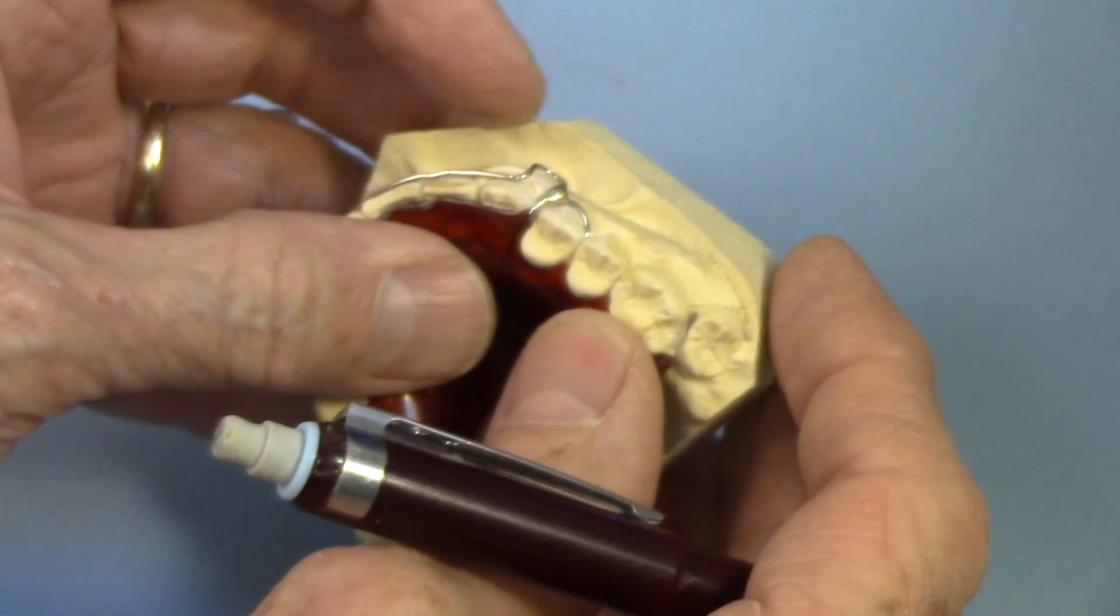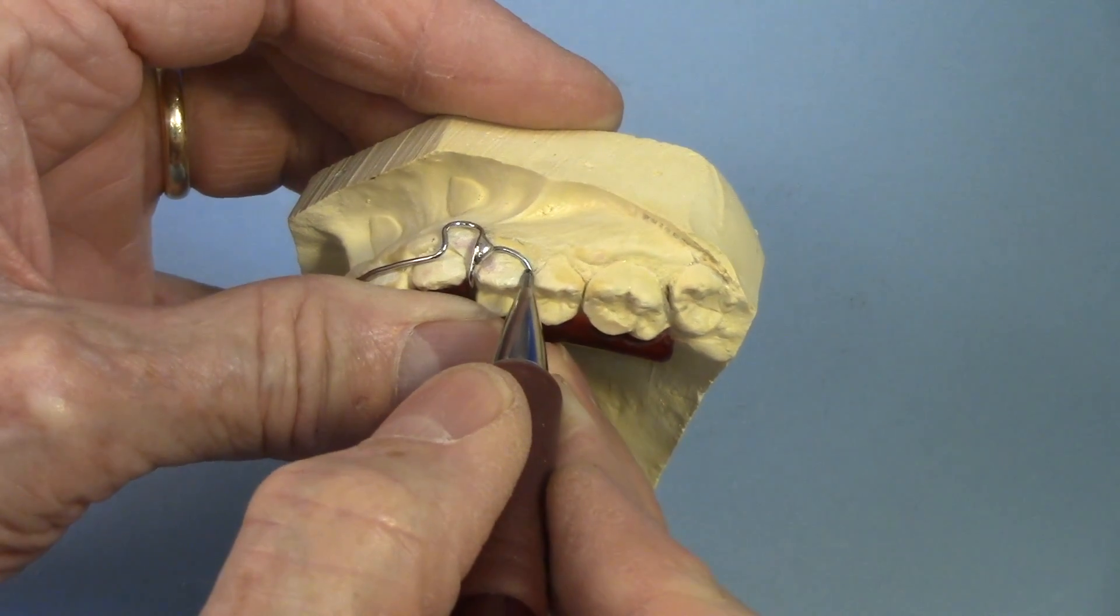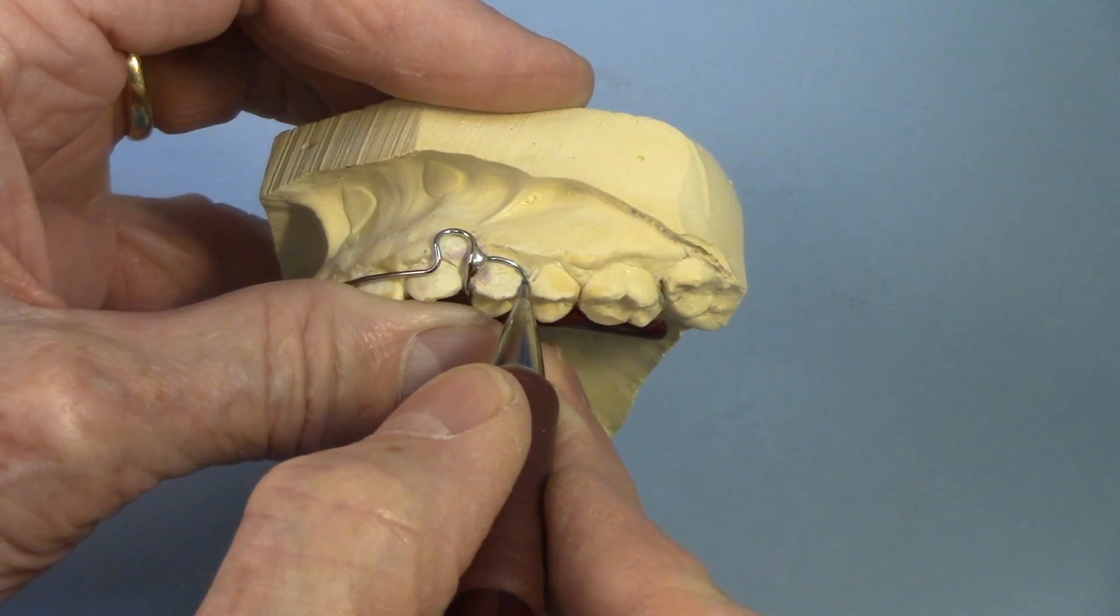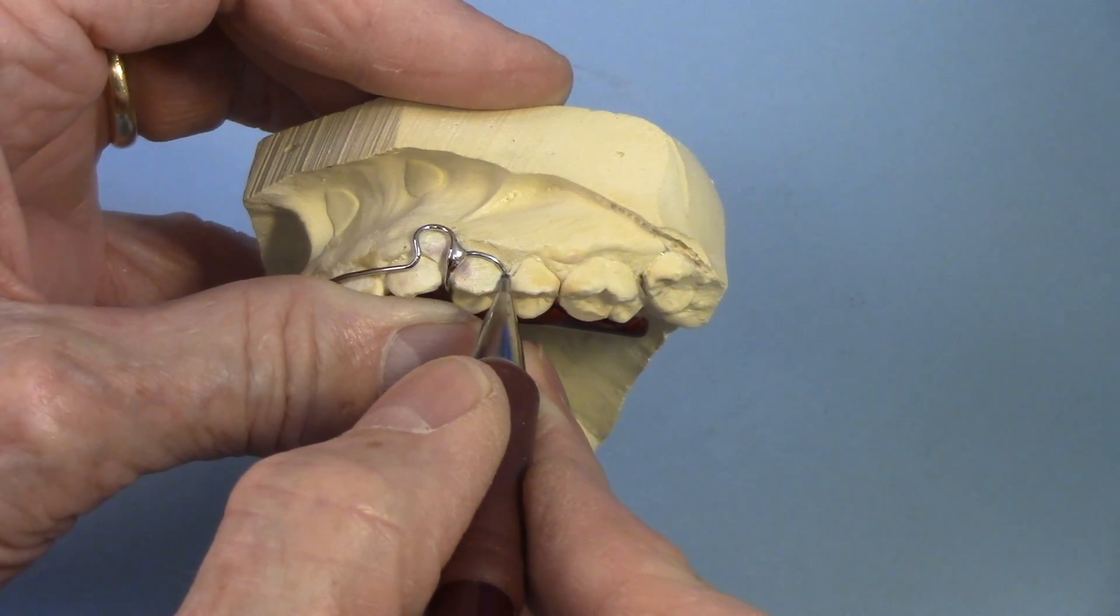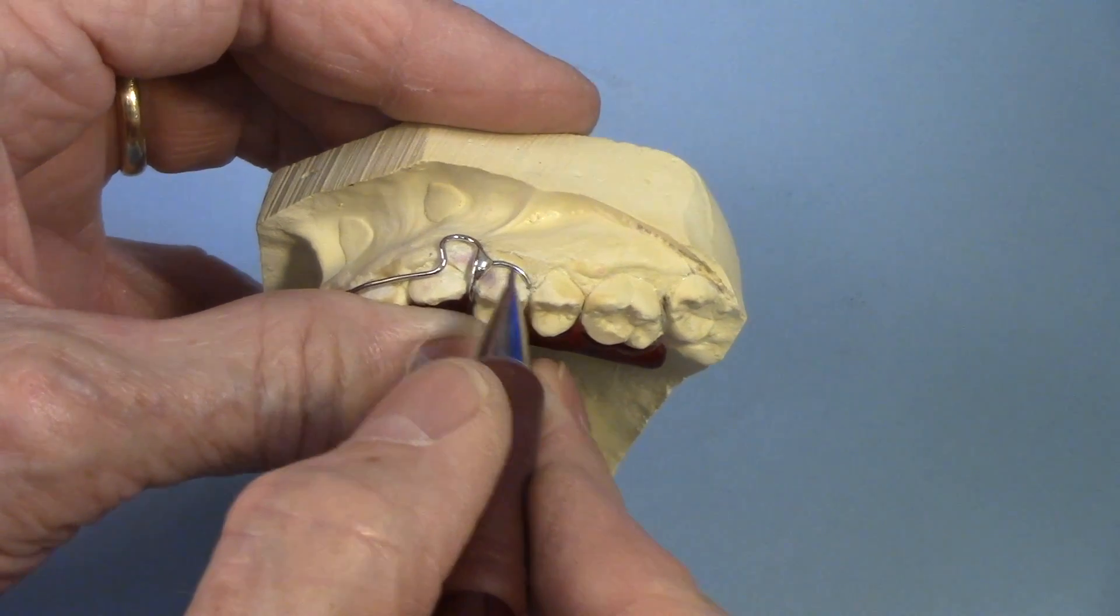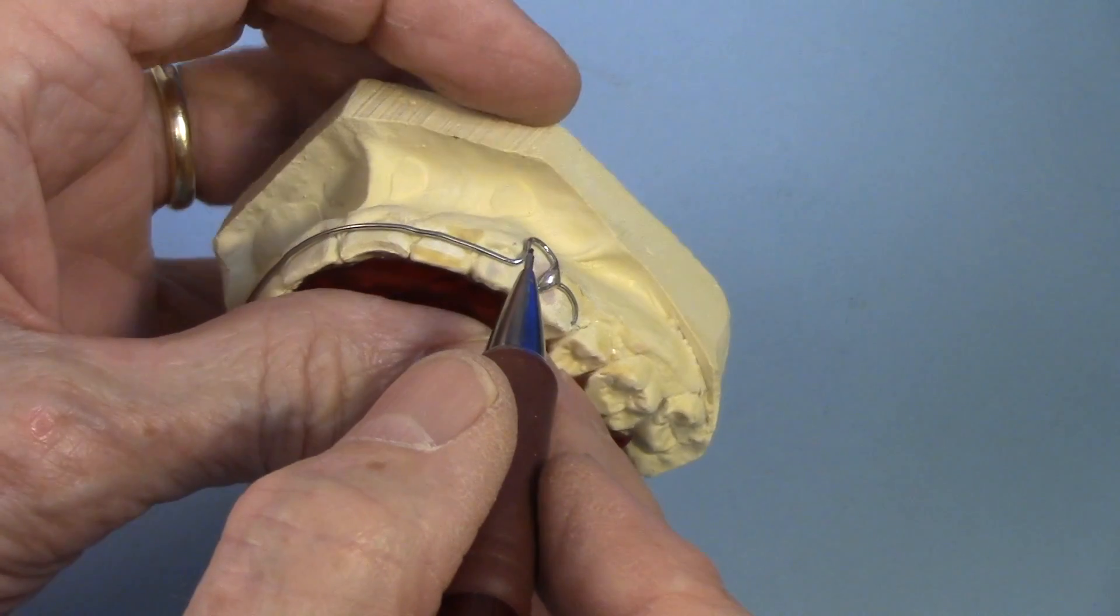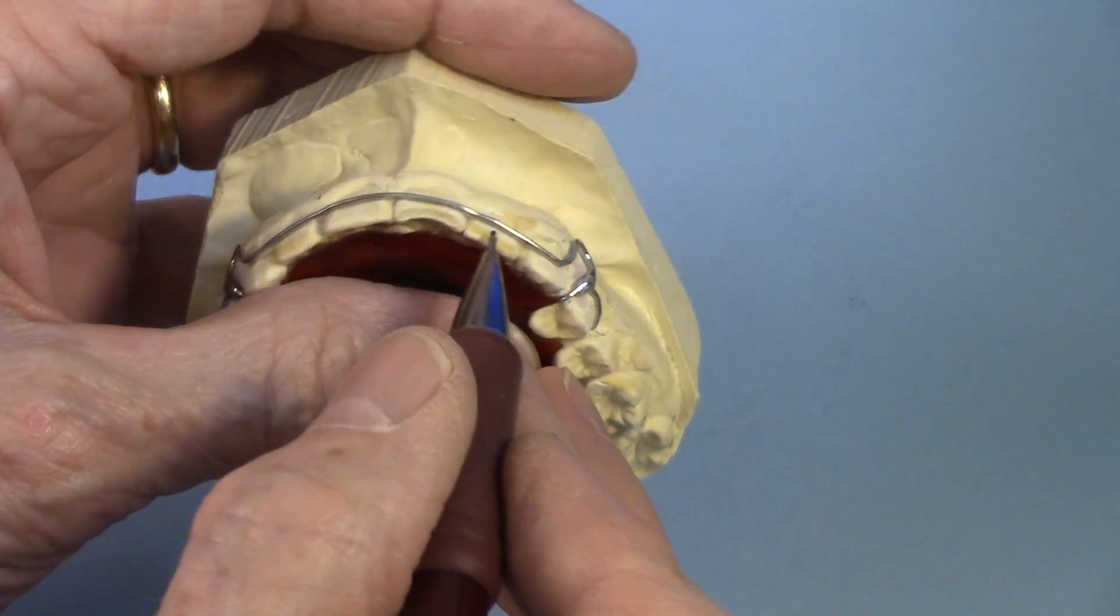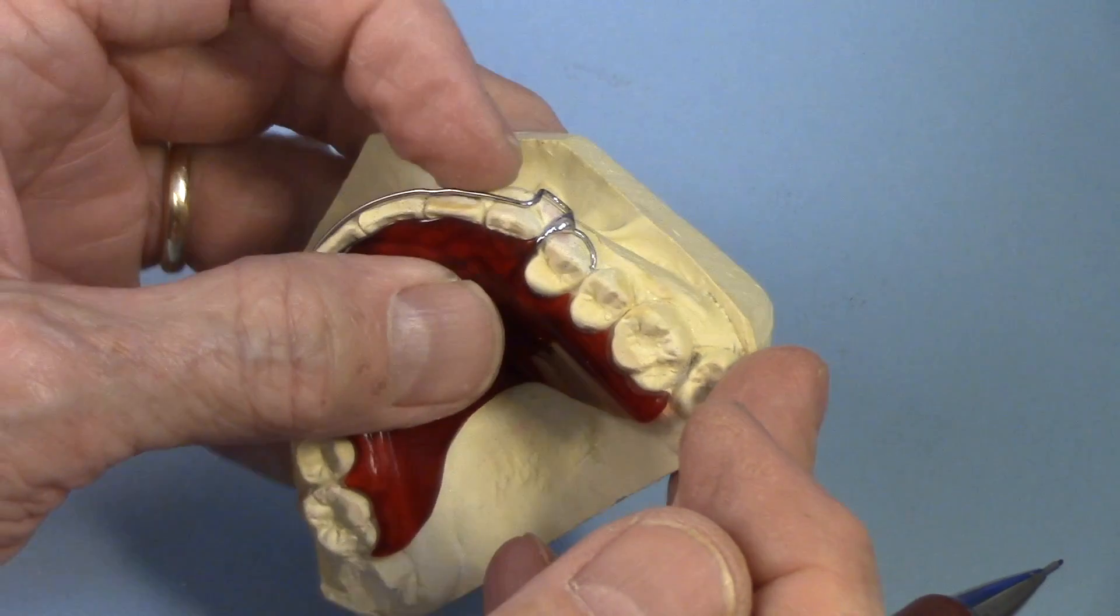But now, if you have a clasp that's like this soldered circumferential clasp here. It is just a freestanding wire and its retentive value comes from the end of this tucking into the embrasure. Now, if this were a soft wire, it would bend real quickly. So this has to be a spring hard wire. But you could have it soldered to a cobalt alloy wire or a soft nickel chromium wire if there's no movement needing to be done with the anteriors. If it's just for a retentive value only.